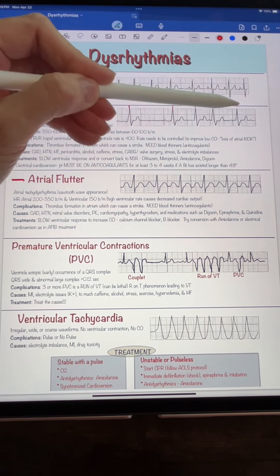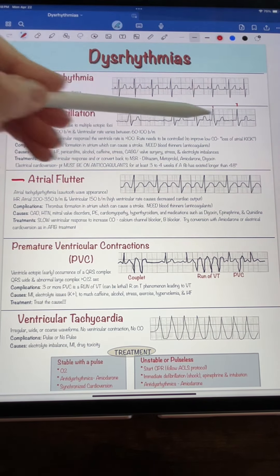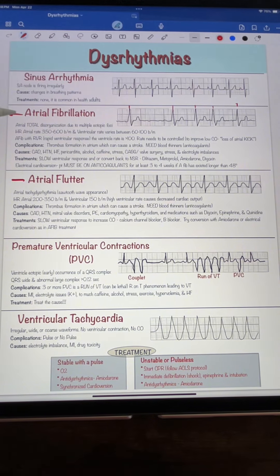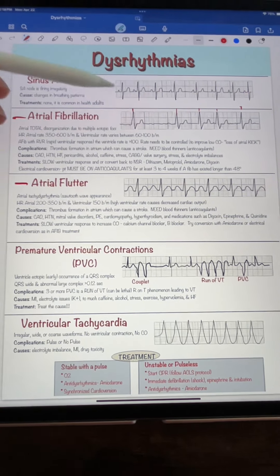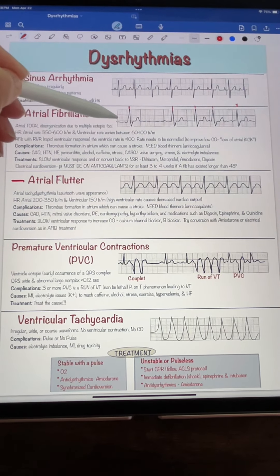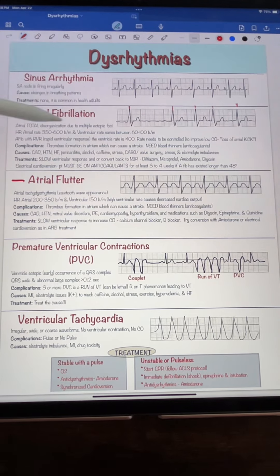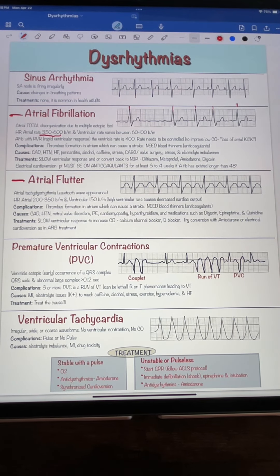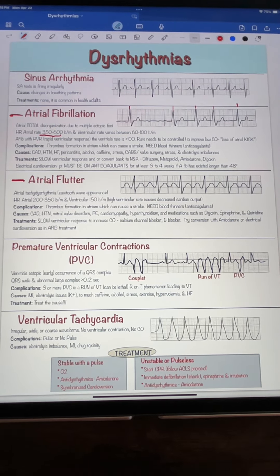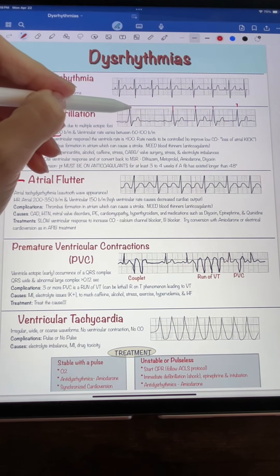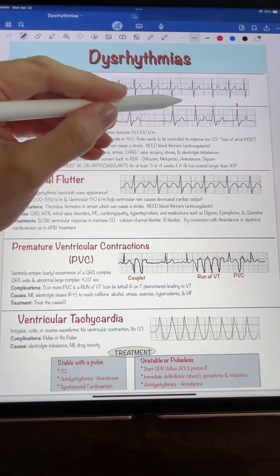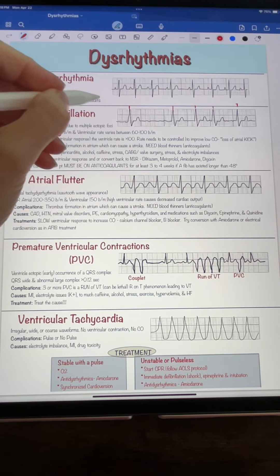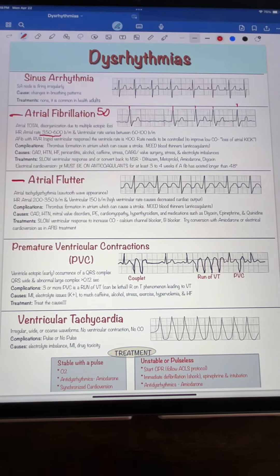We're looking at a six-second strip of atrial fibrillation. We can't count the atrium because it's quivering — see this fine line going around at about 350 to 600 beats per minute; it's too fast to count. So we look at the ventricle: one, two, three, four, five — our ventricular rate here is 50, so the heart rate monitor would say 50.